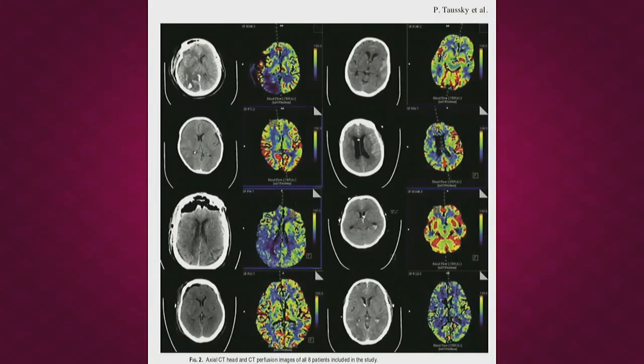What I wanted to quickly show you are the limitations of NIRS. In the upper left, you can see a hemorrhage in the right occipital pole, that purple-blue bad-looking brain. Purple and black don't come back as often in the analogy. This is not a good candidate for frontal NIRS, right? If you're monitoring the patches up front, you're not going to see that area, so that's a limitation.